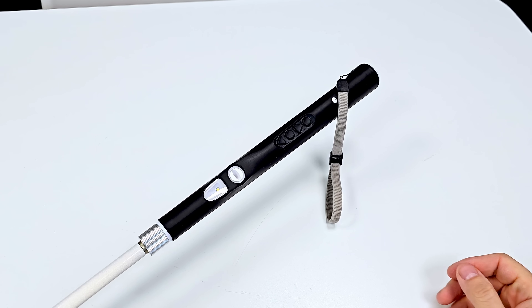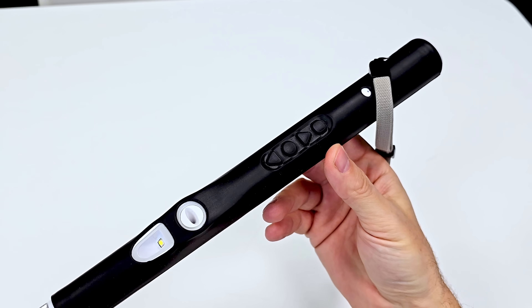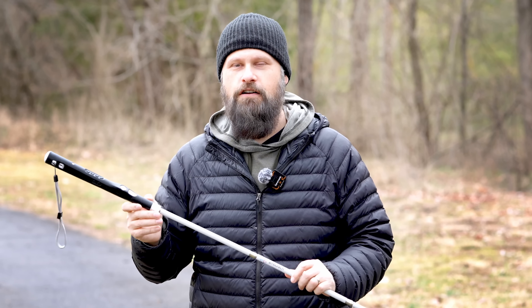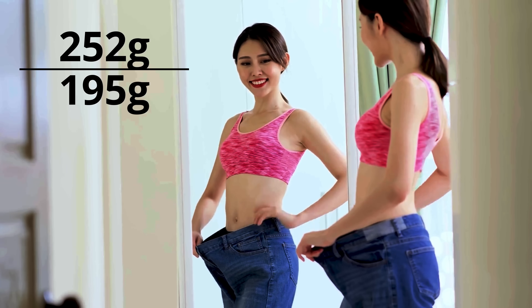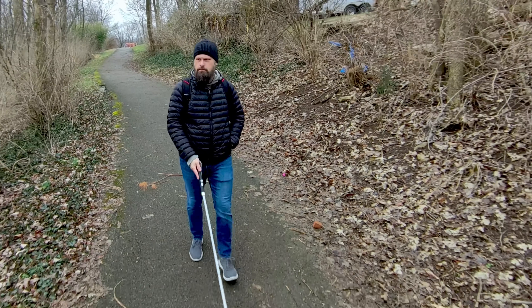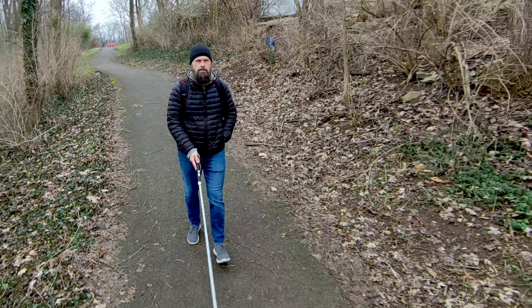The handle looks and feels like a regular cane handle. It's a slimmer design and much more lightweight. The WeWalk Cane is now about 40% lighter than the previous version — going from about 252 grams down to about 195 grams. This is definitely going to improve performance and you're not going to get tired using the cane for long periods of time.